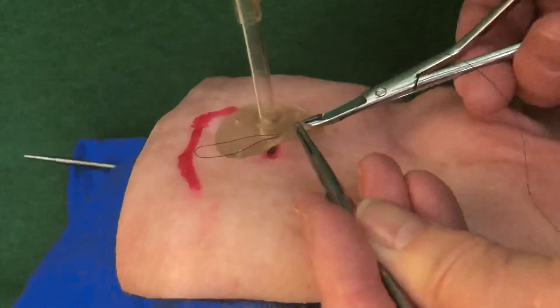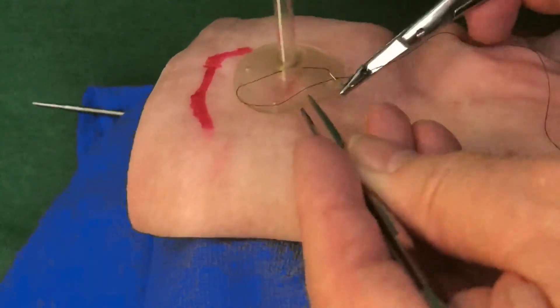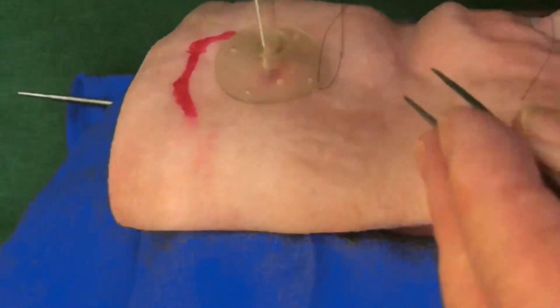That was the reason for putting in the subcutaneous local anaesthetic to a diameter of approximately 2cm. Cheerio!